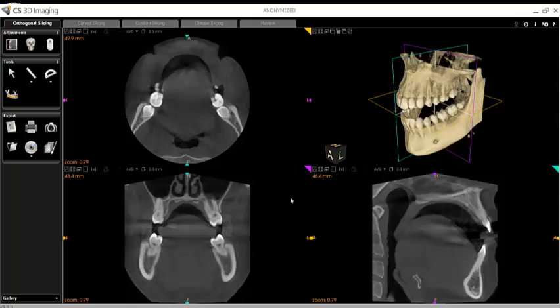Alternatively, if you are working directly from a scan in a folder, you may open the folder, left-click and drag any DICOM or DCM file from the folder, and drop it right on top of the desktop CS3D Imaging icon to open the scan.